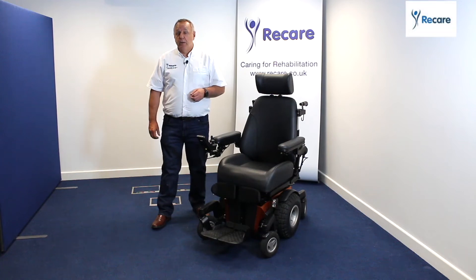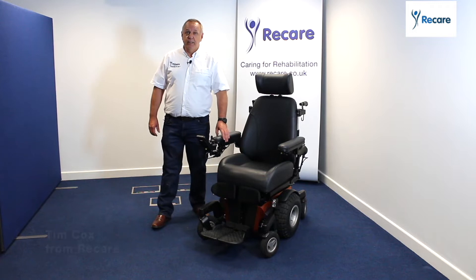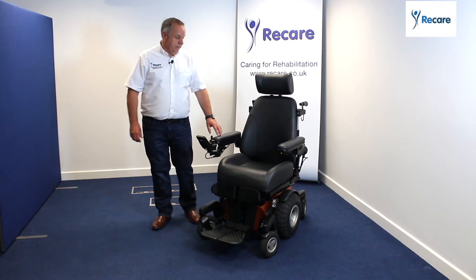Hello, my name is Tim Cox from a company called Recare. I'm going to take you through the 360, the latest power chair from Sunrise Medical, designed by Magic Mobility, the well-known off-road power chair development company.